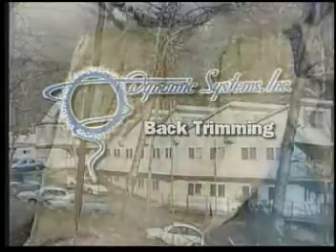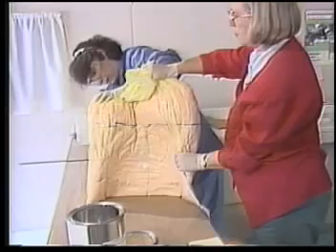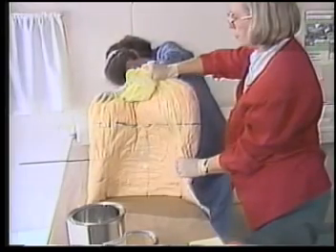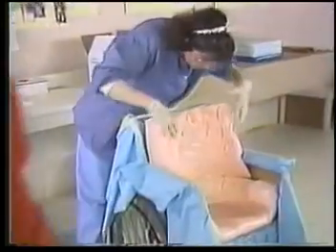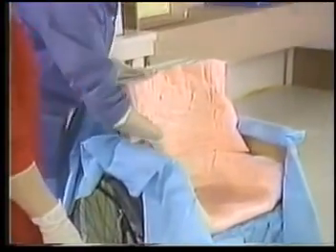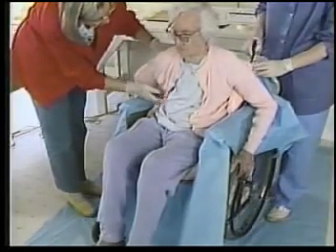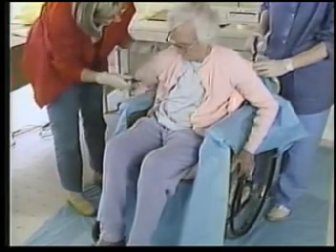Once the foam process is complete, examine the insert. Mark areas for the first rough trim. Trim off excess material with an electric knife. Once the rough trim is complete, replace the back insert in the chair for a second stage of fitting. Return the client to the chair to mark where additional trimming is required for the final fitting.